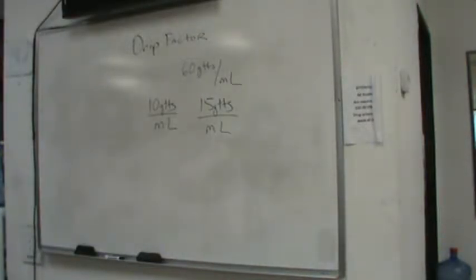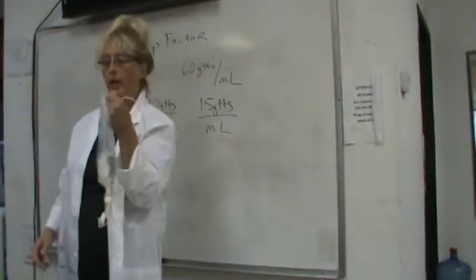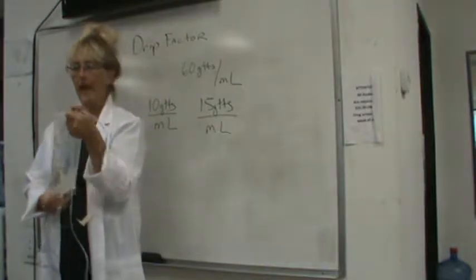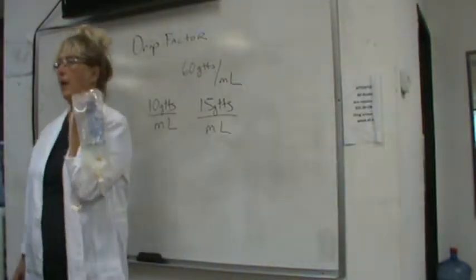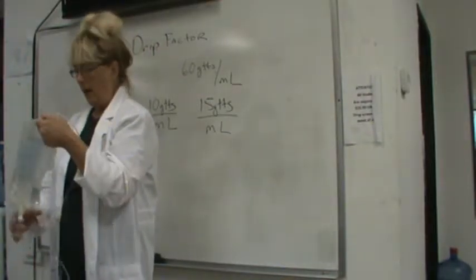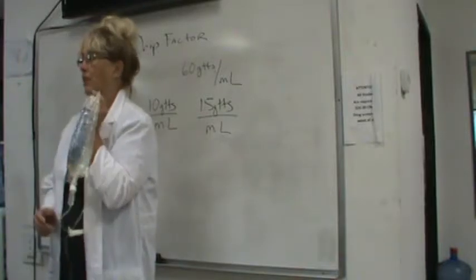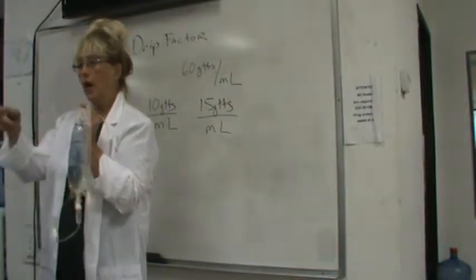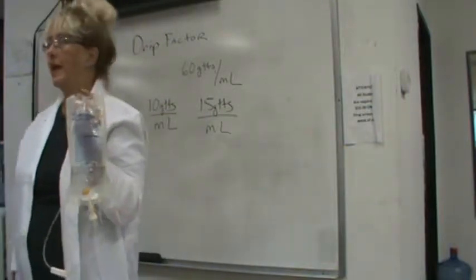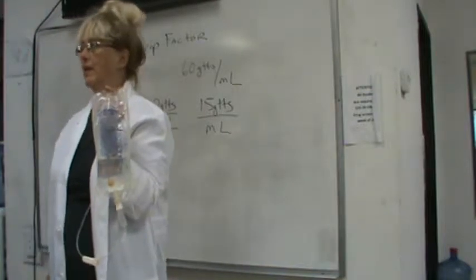Okay. So this is a bag of lactated ringers. Okay? Typically, lactated ringers, depending on what the additives are, can be hypertonic or hypotonic. But you can see it's got a lot of different additives in it. Look at your IV bags. Your IV bags are basically normal saline, aren't they? Yeah. What does it say? 0.9 normal saline, right? Yes.